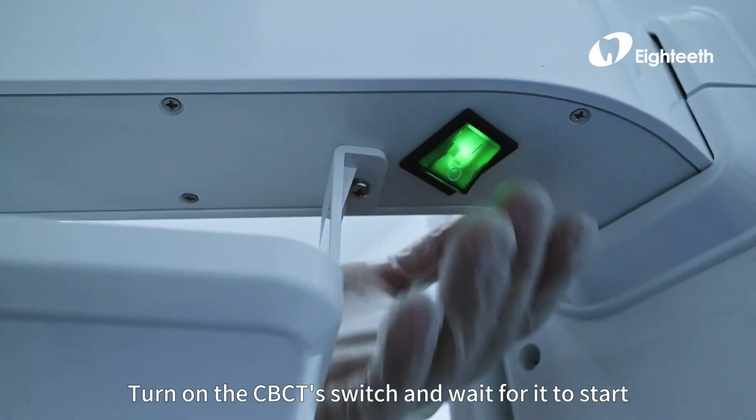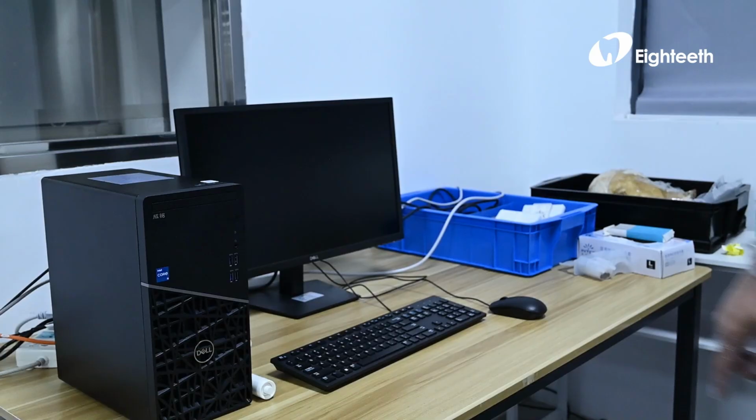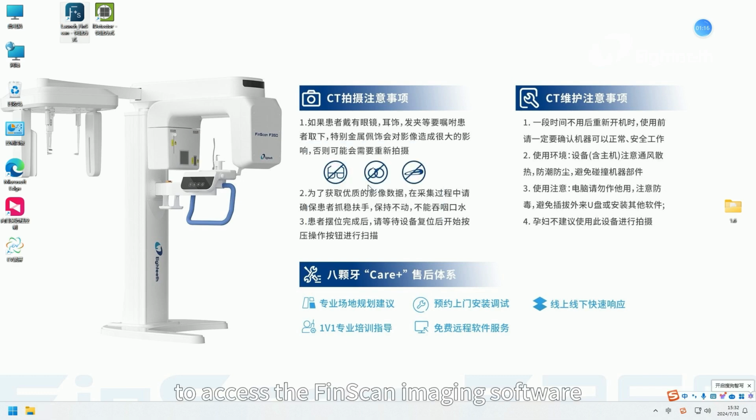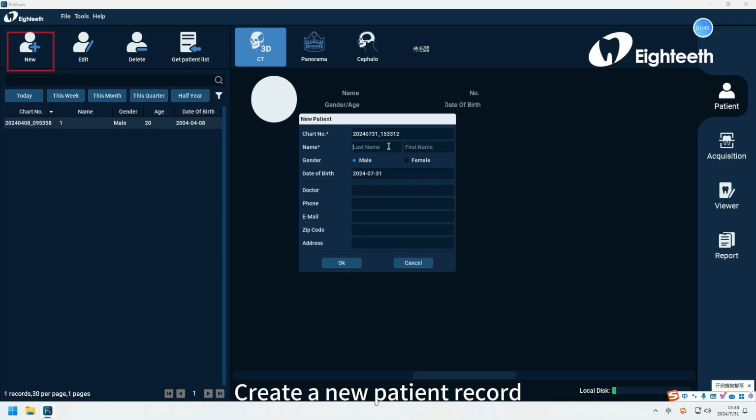CBCT switch and wait for it to start. Turn on the computer host. Open the FinScan imaging software. Enter the password to access the FinScan imaging software. Create a new patient record.